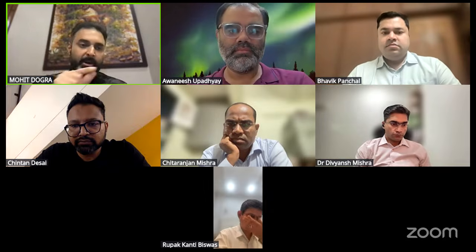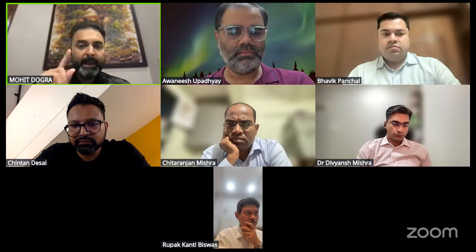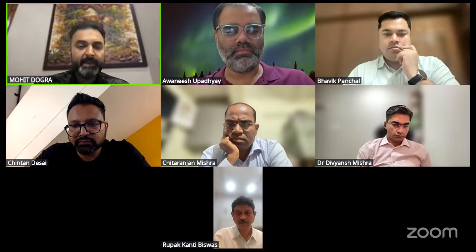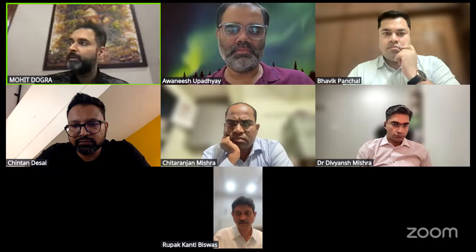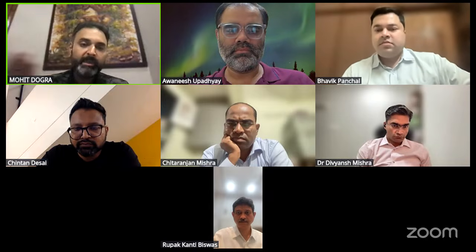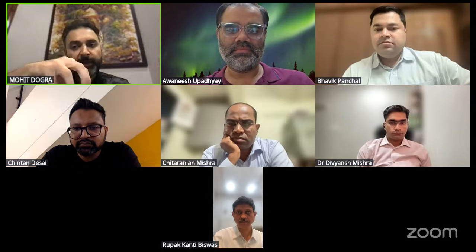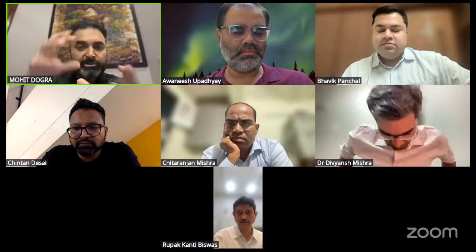And I'd like to point out the second video that Avani showed and the video that Dr. Chintan also showed, and I would give a big shout out to the initial video by Dr. Bajpai. I think that is the way to go. She said it very well, and Divyansh also mentioned this briefly in his comment. You want to stay away as much as possible after you fashion those flaps. You don't want to be trying to nudge them into the hole.